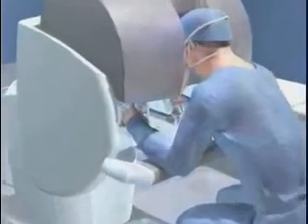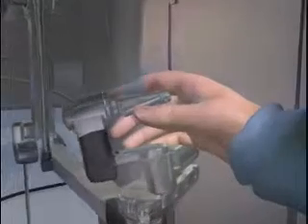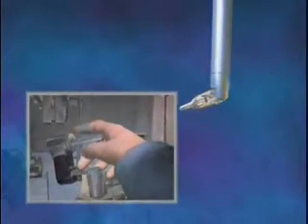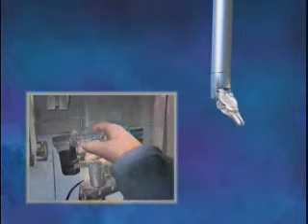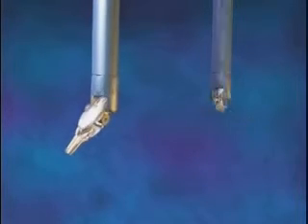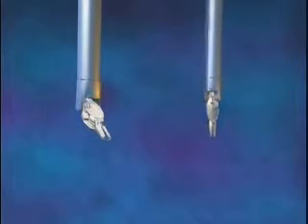The computer-enhanced system scales the hand movements of the surgeon at the console down to micro movements of the surgical instruments on the patient-side system. Unlike standard laparoscopic instruments, the specialized DaVinci instruments can articulate and rotate 360 degrees with unparalleled precision and flexibility.